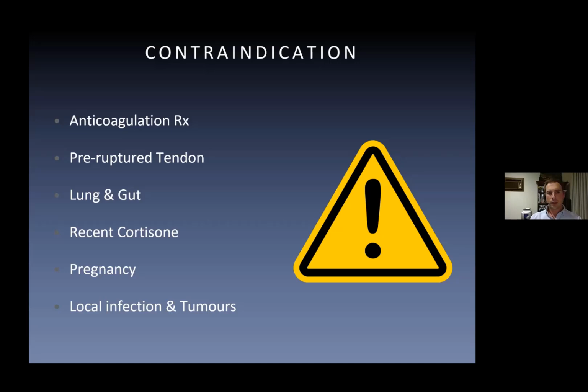Lung and gut. Recent cortisone, and this is about 6 weeks. There is no specific evidence that says shockwave after cortisone is detrimental, but it just hasn't been researched. And the cortisone, due to its potent immunosuppressive and anti-inflammatory effect, is likely going to reduce the effectiveness of your treatment.